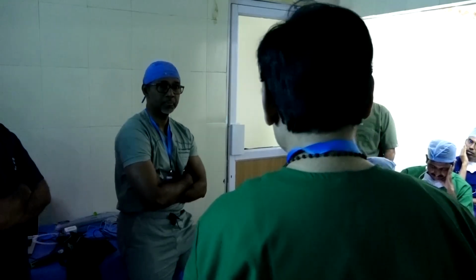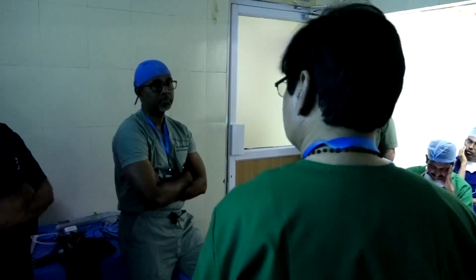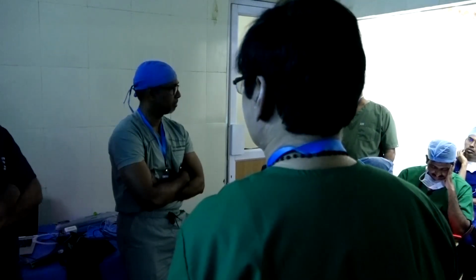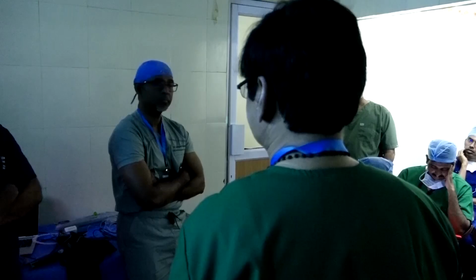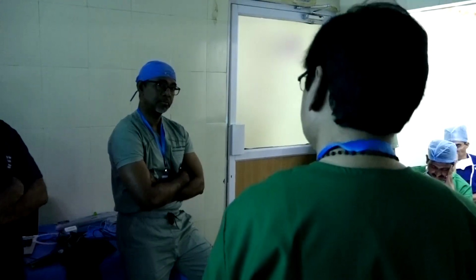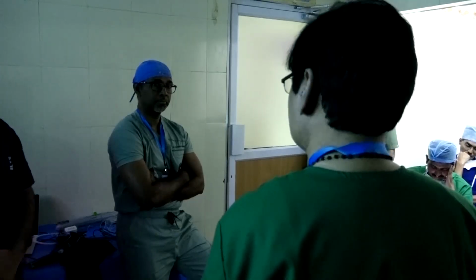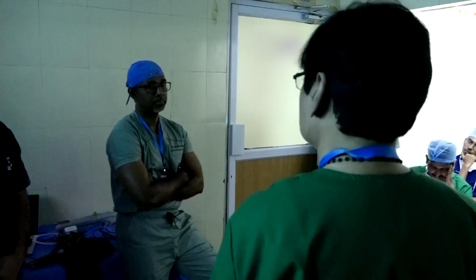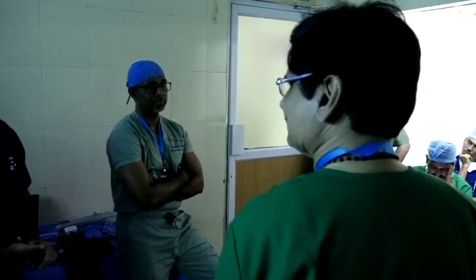But in a long segment CTO, laser has more role, for balloon-uncrossable to crossable lesions. You need not exchange the wire, the same wire works. That is the advantage with the laser. Again, you have to go very slowly, millimeter by millimeter, like orbital.